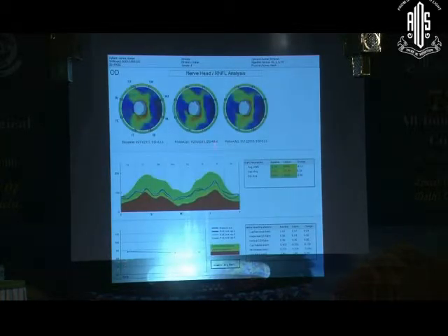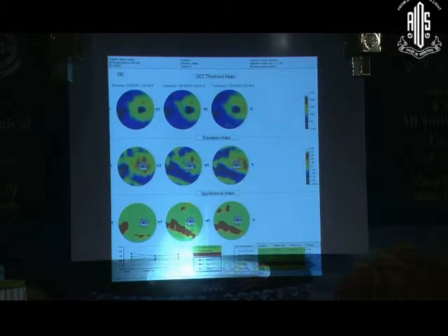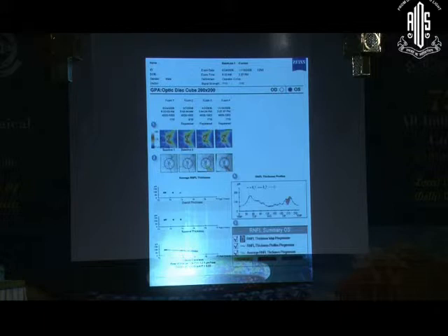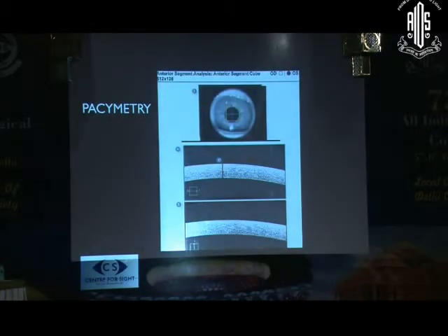In OptiView you can scan up to four scans at a time and look at the thickness, the numbers, the profile, and change over a period of time. In this map you can see the donut increasing. Cirrus color-codes findings yellow when they are 5% off from baseline and, if consistently present, shows them as red.